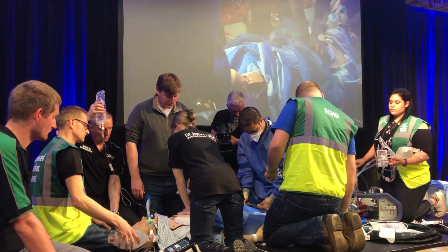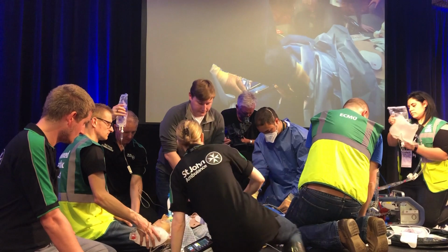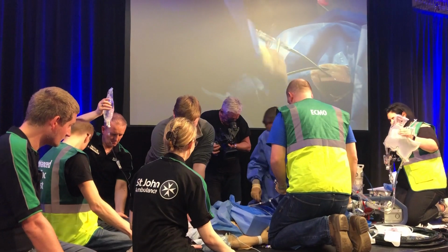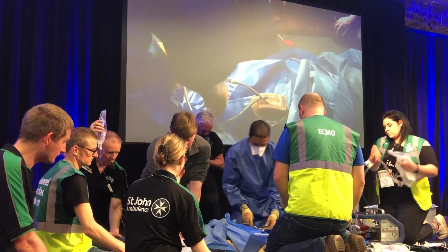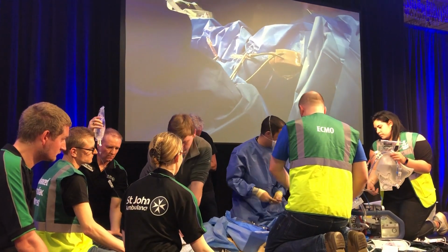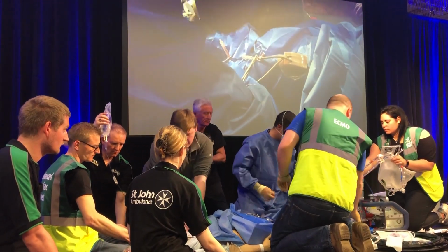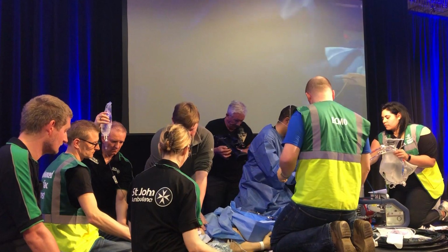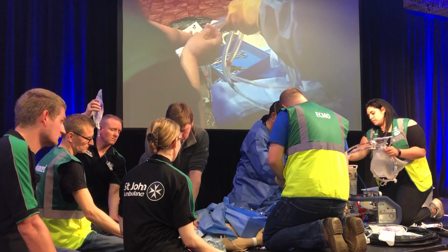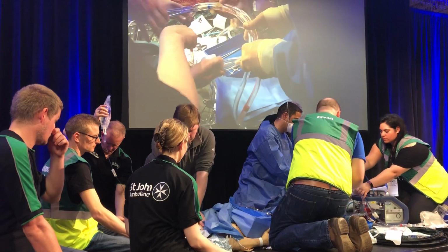So when Mamoon's got the big pipes in, he's going to take the circuit from the perfusers, which is a sterile circuit again. When he connects up, within a minute there'll be what's called full flow. And at that point, the rest of the team can kind of breathe a sigh of relief. We still ventilate patients, which is something else that people ask, but you don't need to ventilate very hard. You can lung protect on a slow respiratory rate and bring the FiO2 right down, because the ECMO is doing the job of the lungs.